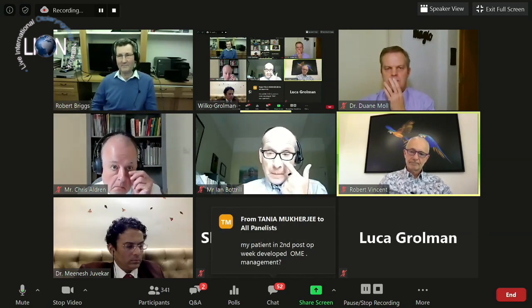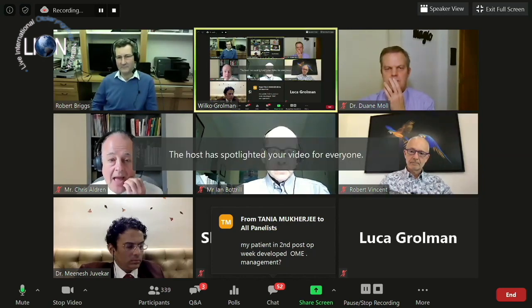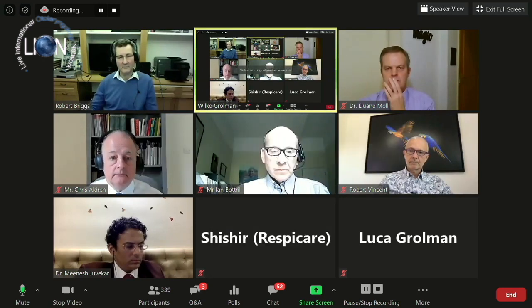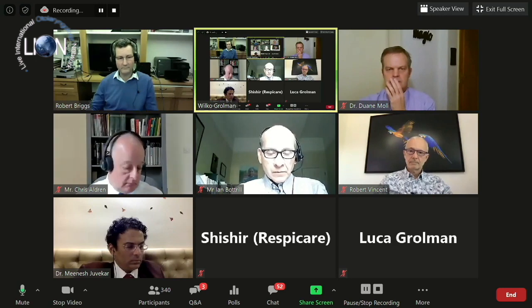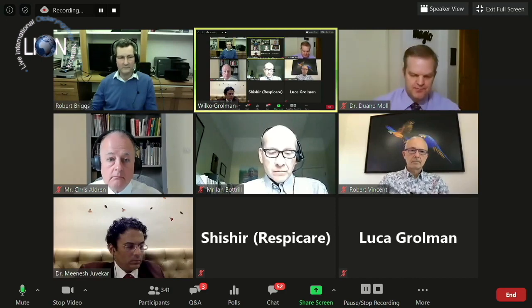Yes. I think the important thing as well is, if you're using single shot with a micromanipulator without a fiber, collimation is absolutely vital. We've seen in the past the focusing beam in one position and the laser going in a different direction. I have two facial weaknesses in my series, both back in the very early 1990s, both of which got better, but they were both associated, I suspect, with heating by the laser.